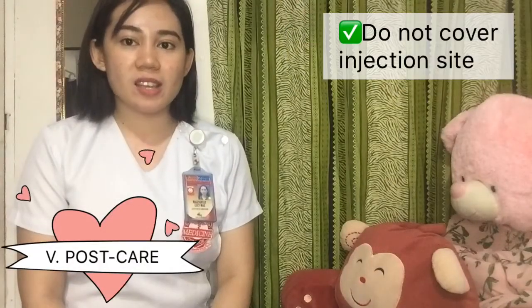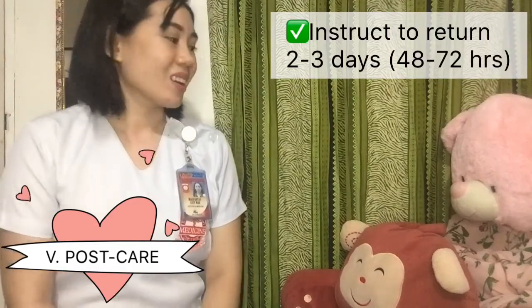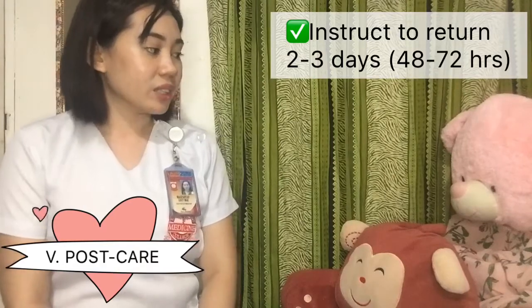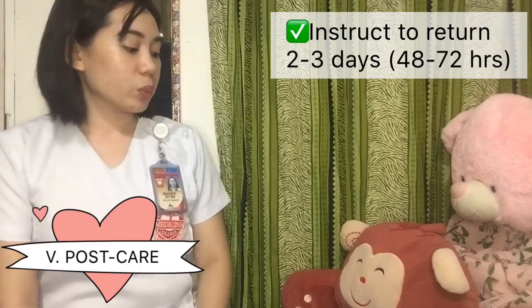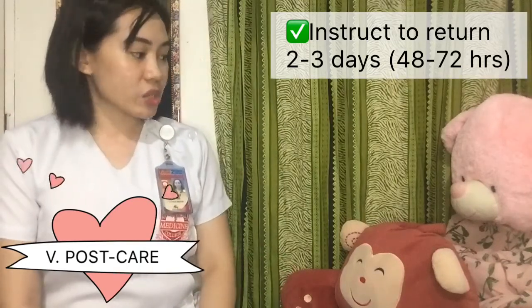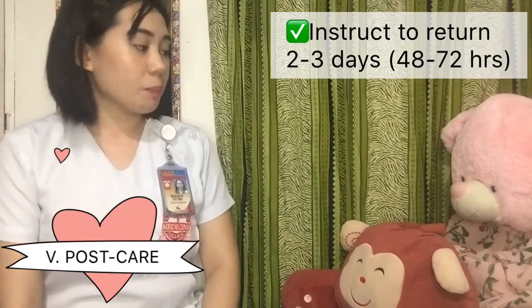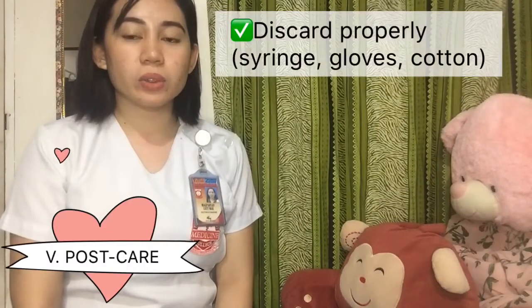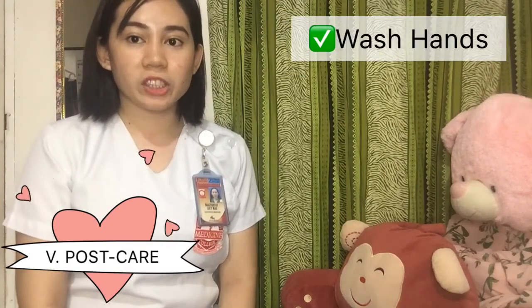As part of post-care, do not cover the injection site, and instruct the mother when to return with her daughter. Ma'am, we're done already. Please come back together with your daughter in 2 to 3 days so that we can see the final result of the PPD test. If you fail to come back, we may need to redo it. Don't forget to discard the materials used according to proper disposal guidelines, and lastly, don't forget to wash hands.